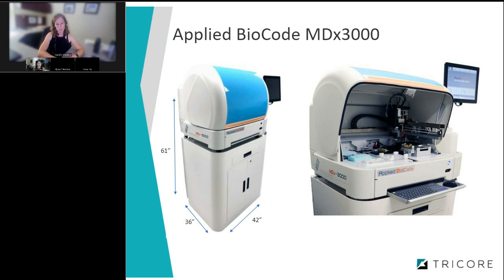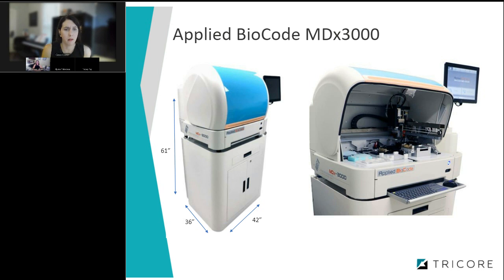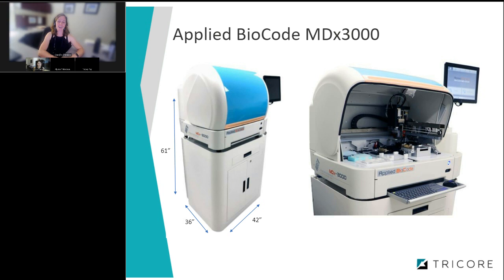And for solid stool, is it the 10 microliter inoculation loop that you use? I believe so, but I could be wrong on that. I haven't actually performed a run on this for a couple of years since the validation concluded.